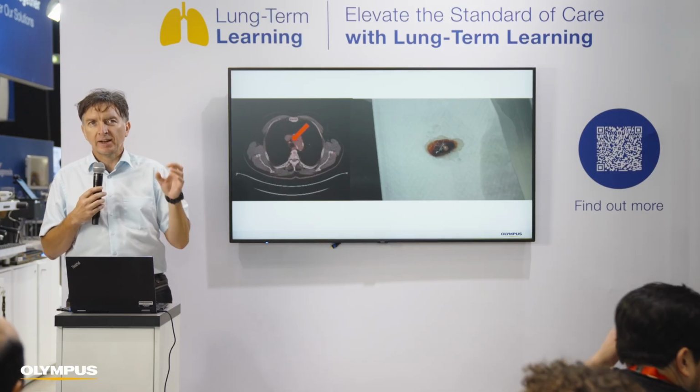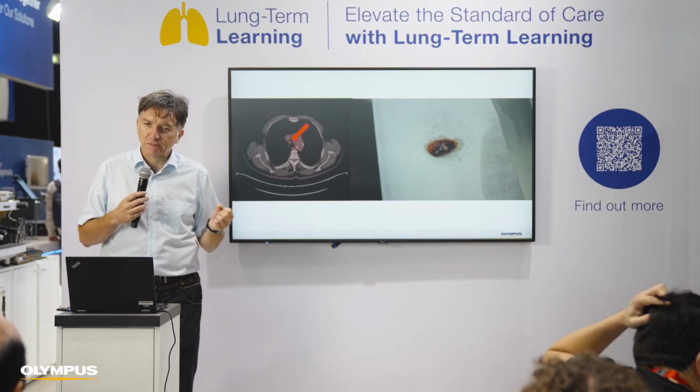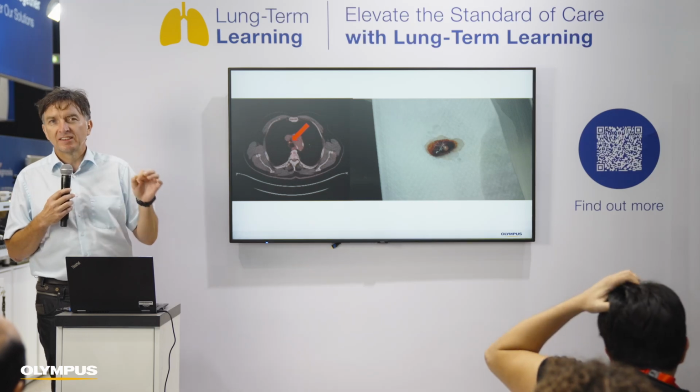Either we have small hard parts, which could also be metastasis inside the lymph node, and we can target them accurately. And on the other side, when we have big necrotic lymph nodes, when we puncture to get a diagnosis, we avoid soft areas where there is necrosis and bad cytology, and we find the areas of the lymph node or the tumor, whatever we puncture, which are hard, which are blue, and take a sample from that area, and we are more confident that our sample will have live tissue and vivid cells, which would bring the diagnosis up.